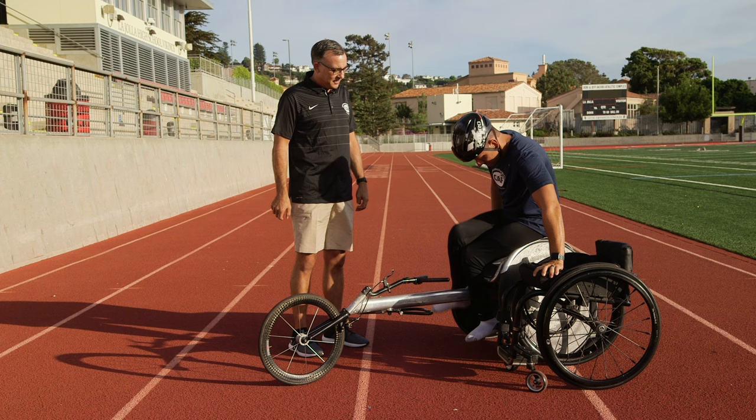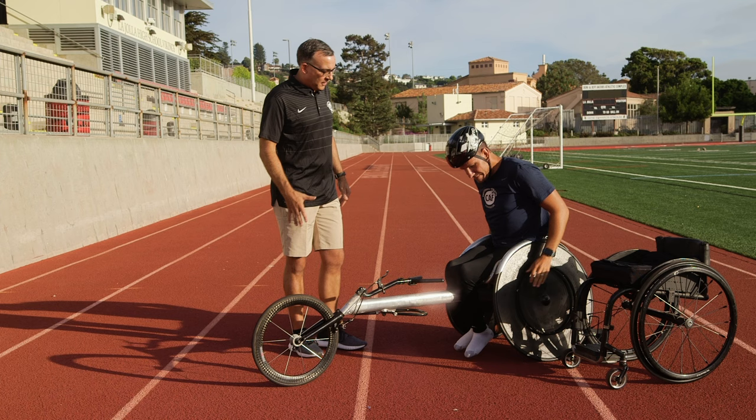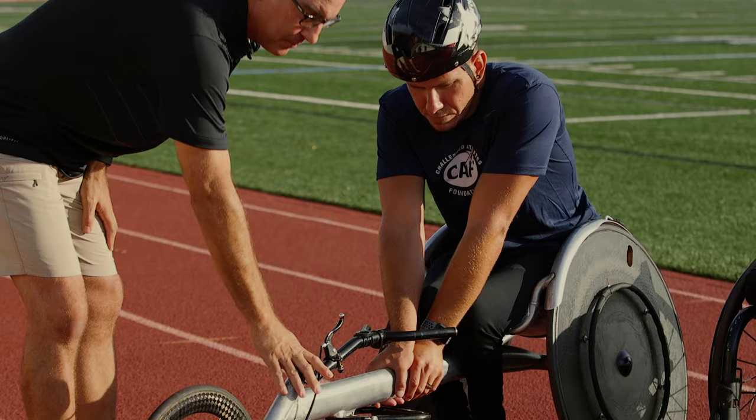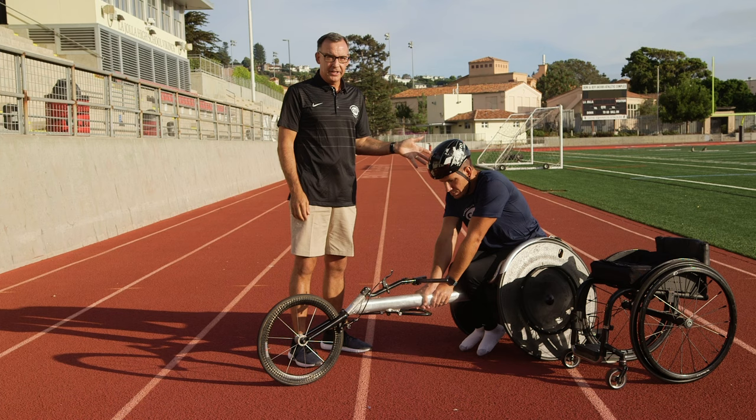Eric is a professional, so he makes this stuff look pretty easy. I would caution coaches — when people are learning how to transfer into the racing wheelchair, hold the front of the chair down. That's also why we saw Eric put his helmet on, just in case there's a tipping backwards, his head will be protected.